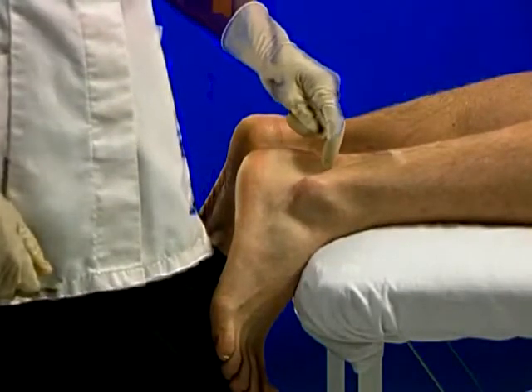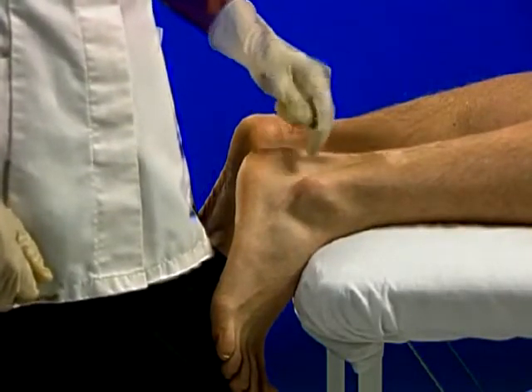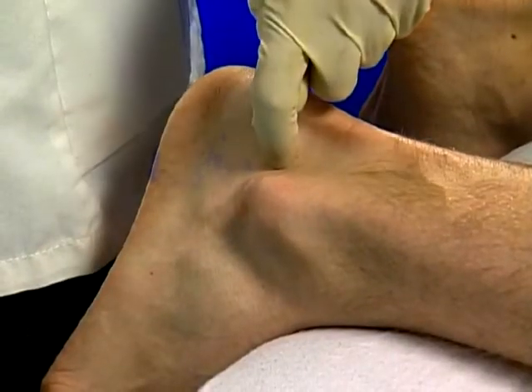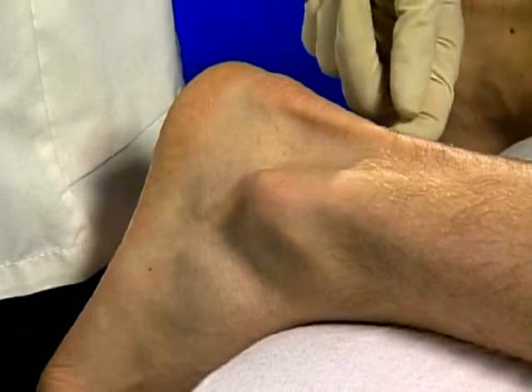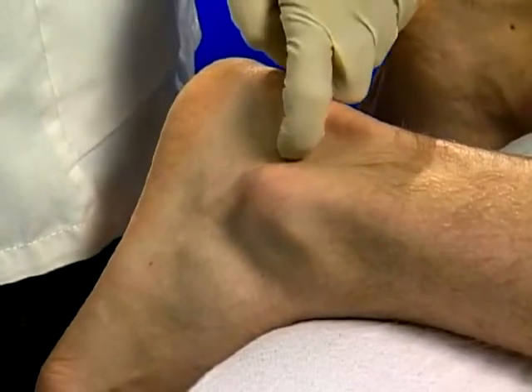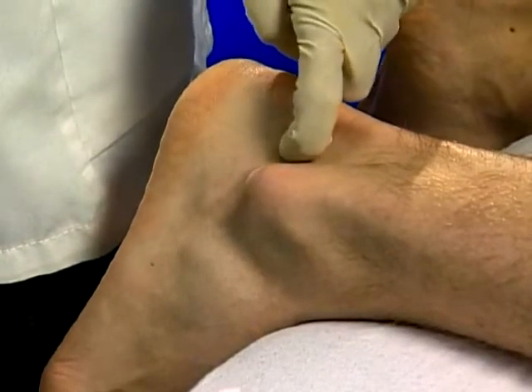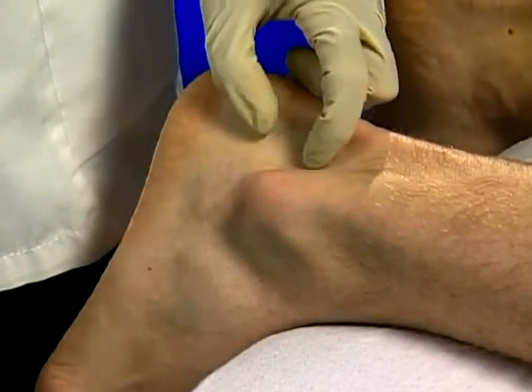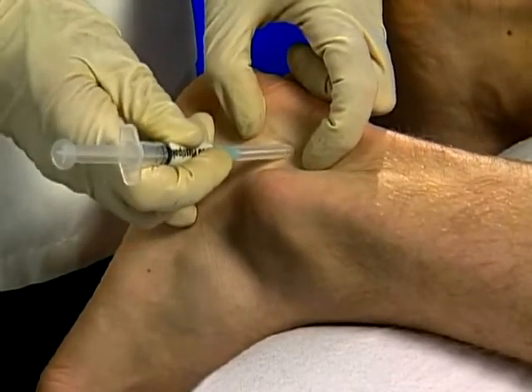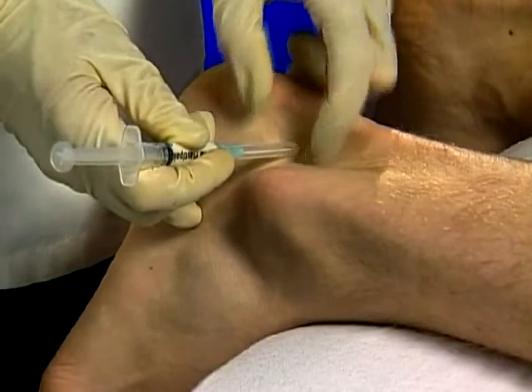The bursa is found in the triangle immediately anterior to the tendon. The safest approach is from the lateral side, avoiding posterior tibial vessels which lie on the medial side. Mark the entry point, clean and firmly stretch skin, and rapidly insert needle perpendicularly just in front of the tendon. Aspirate and inject as a bolus.